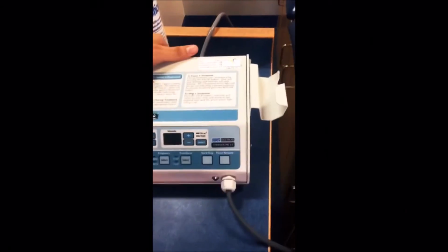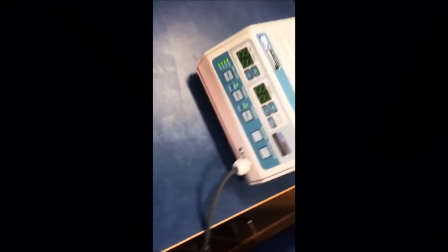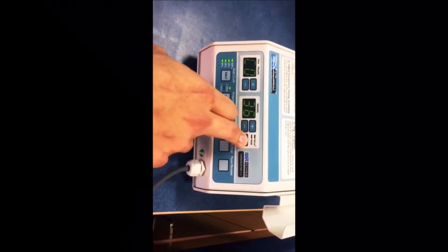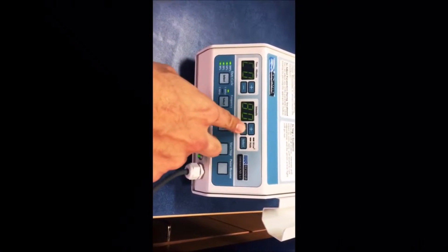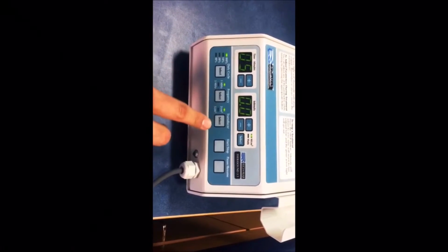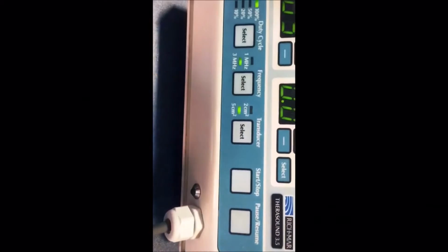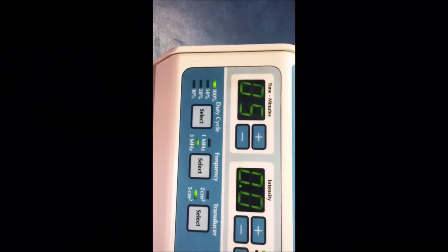Turn the machine on, and once the machine is on, you will set the parameters. These include treatment time, intensity, watts, transducer size, frequency, and duty cycle. The duty cycle refers to either a continuous treatment or a pulse one with pauses in between. The longer the pause, the lower the overall energy output will be throughout the treatment.